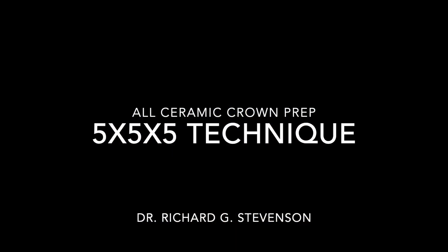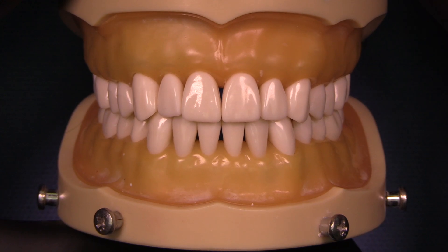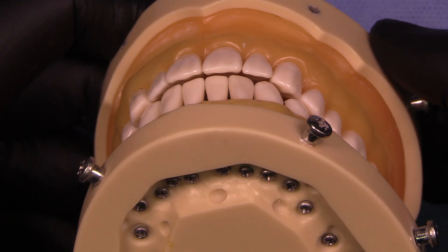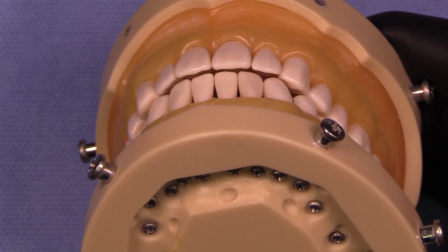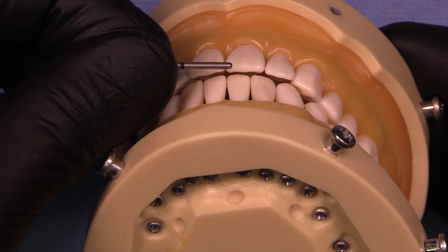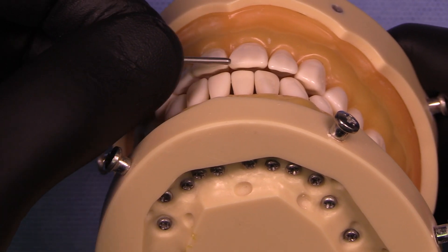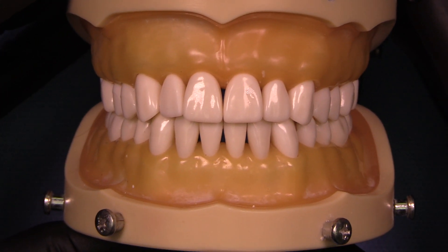Today I'm going to talk about the five by five by five technique for all ceramic crown preps as it pertains to a maxillary central incisor. We're going to work on tooth number eight today using the Kilgore typodont. You can see that sometimes the occlusion is not really socked in — this happens after you've had a typodont for a few years putting teeth in and out. No worries, we'll take this into consideration when we prepare the tooth.